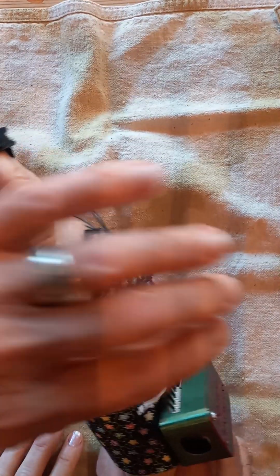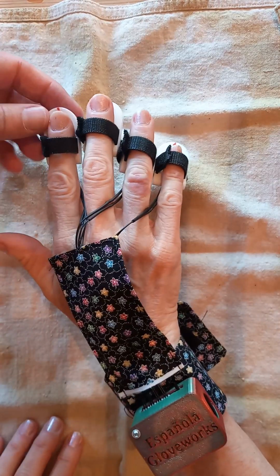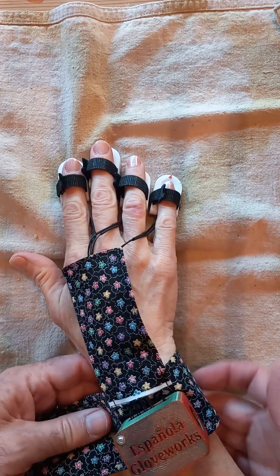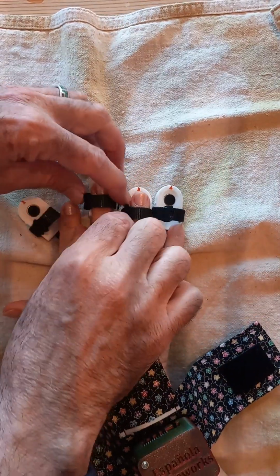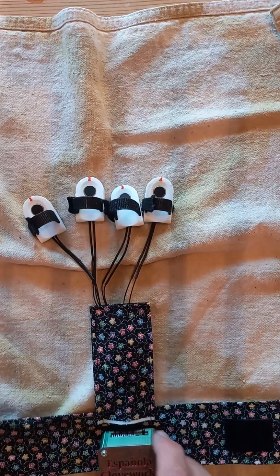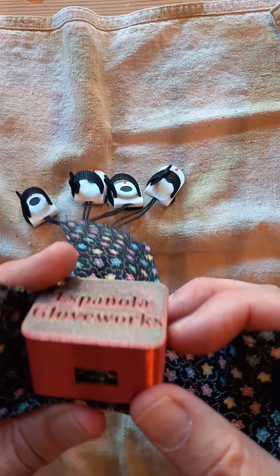Sorry to bend your arm back that way. So I'm now going to turn the switch off, push it away, and we'll hear the fingers stop buzzing. And now let me show you how to charge this thing up. So I'm going to unstrap it from her wrist, gently remove the fingers. Fantastic. Okay, thank you. So now let's try to take a close-up of what's happening there.